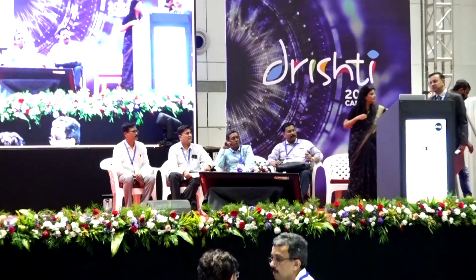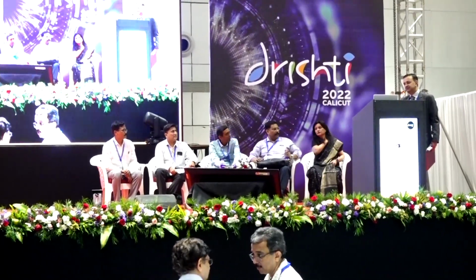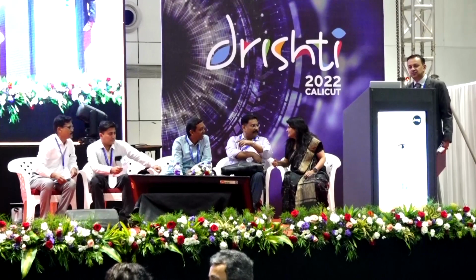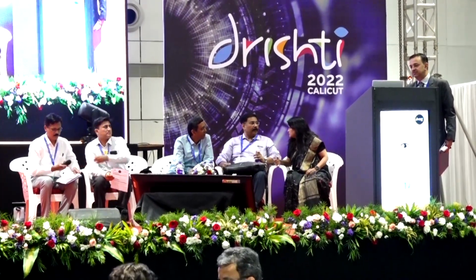So preferably, if it is a clean cut tear, a fresh tear where I am sure that no foci of infection has gone in and the visual axis is quite clear, I would do it as a primary procedure in a single step. That means I would repair the eye, and I might do a cataract surgery. Whether I put a lens or not depends upon my doing an indirect ophthalmoscopy on the table and then doing a secondary IOL implantation if need be.